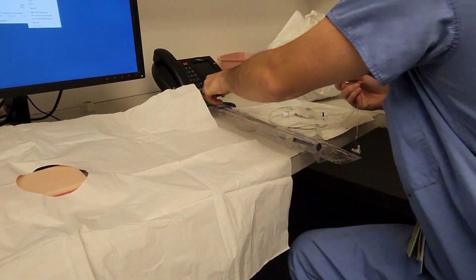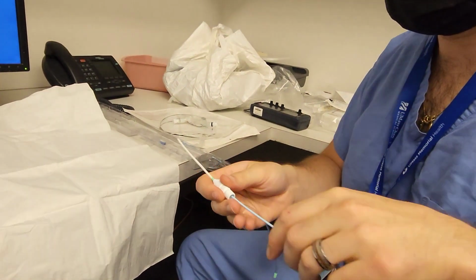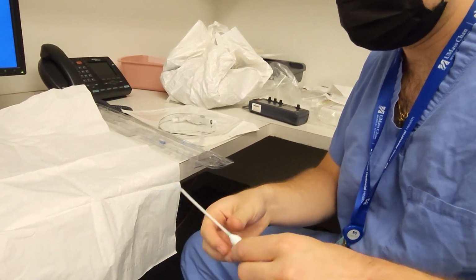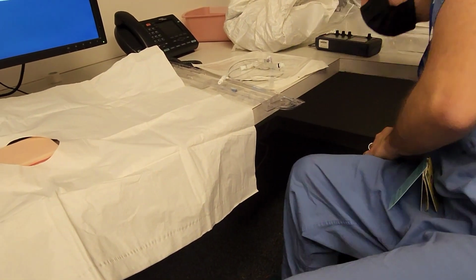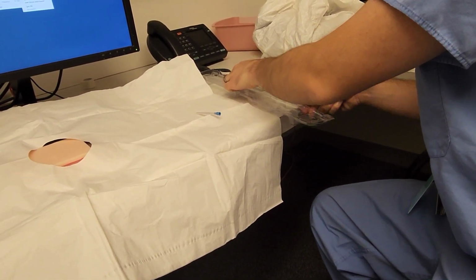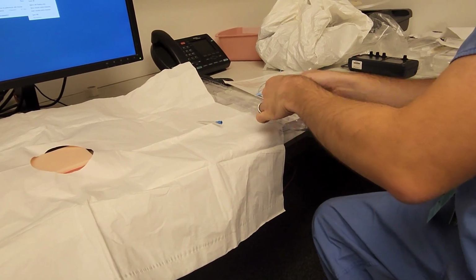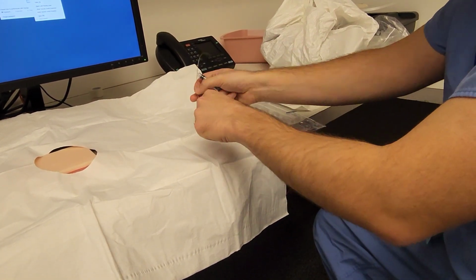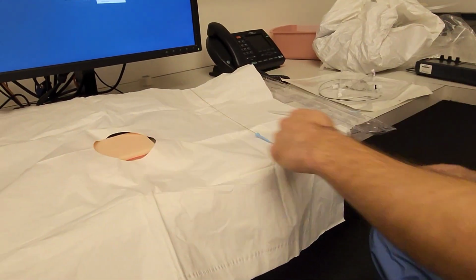After flushing, take the dilator, put it into the cordis, and you can flush that. Now you get your wire ready. And usually for these, I'll just have either a cordis kit or a triple lumen kit open and empty this all onto that, because you can use the lidocaine and the drape from that kit and some of the needles. So you'll anesthetize with lidocaine first.